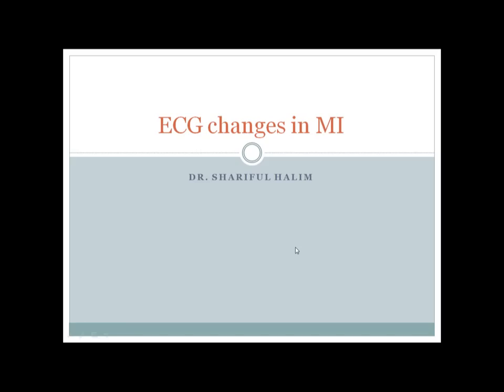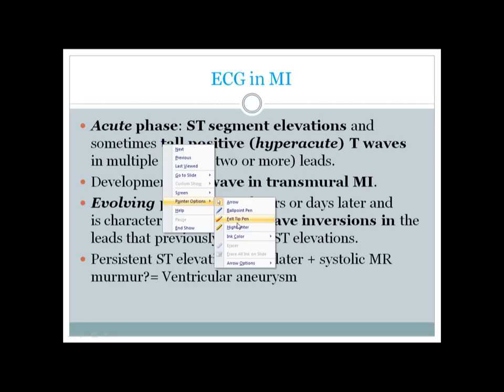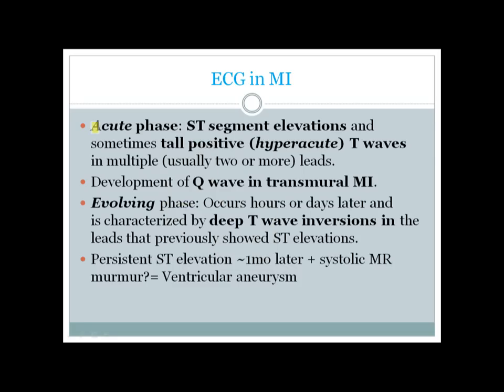Everyone, welcome. In this short video presentation, I'll talk about the typical ECG changes in MI or myocardial infarction. The typical ECG changes in myocardial infarction can be divided into two phases. One is the acute phase and the other is the evolving phase.